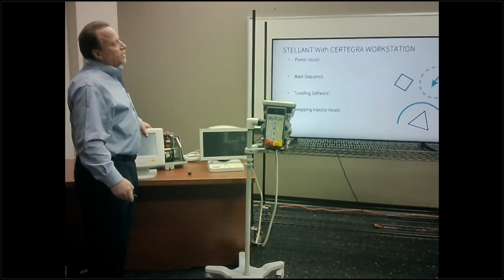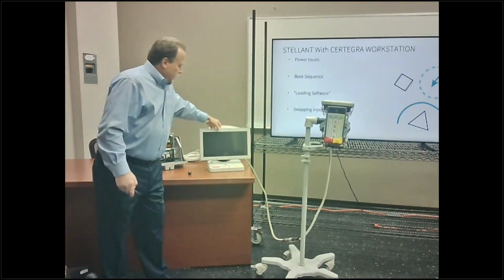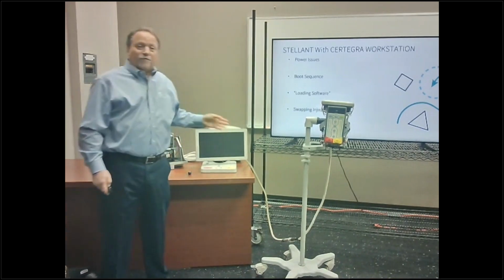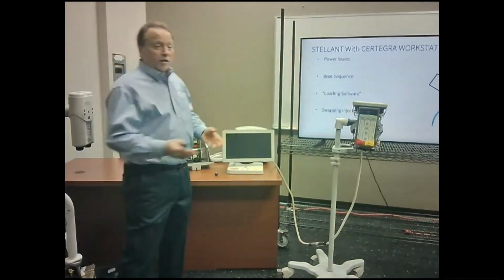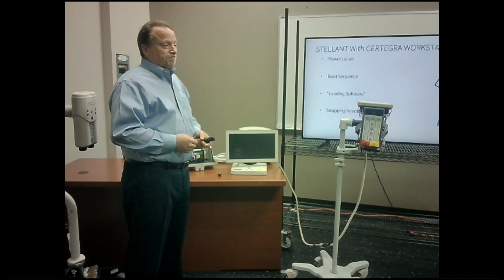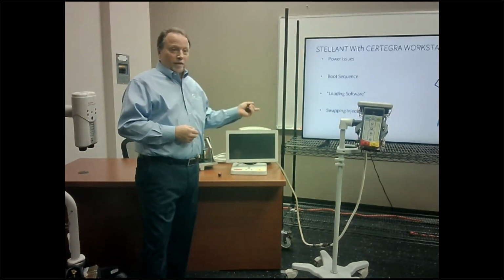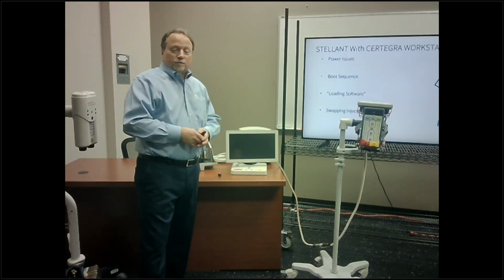So we're going to talk about the Certegra workstation now. This is a newer system out there, and I'm sure a lot of you have seen it and are confused by it. I received a tech support call today. They had a power issue last night, and they came in and the workstation was on, but the injector was off.